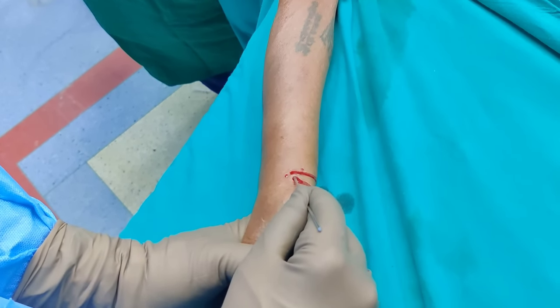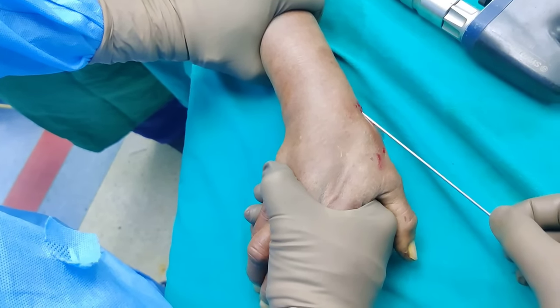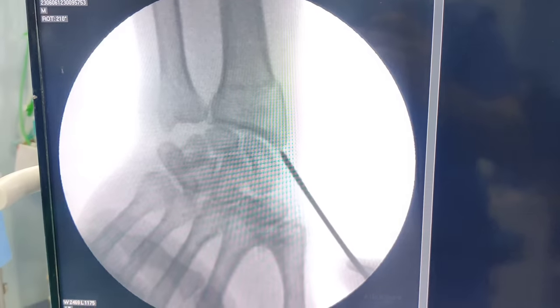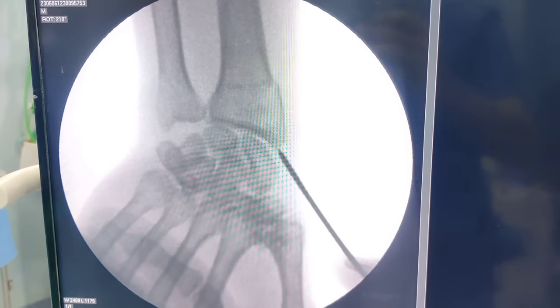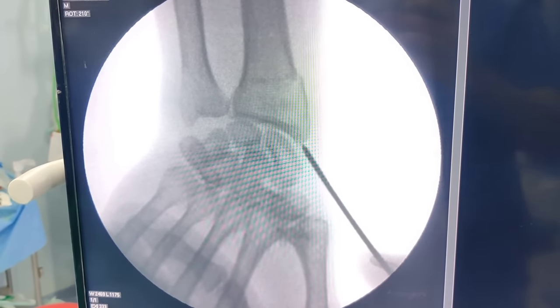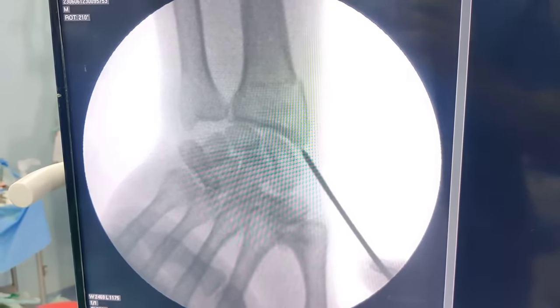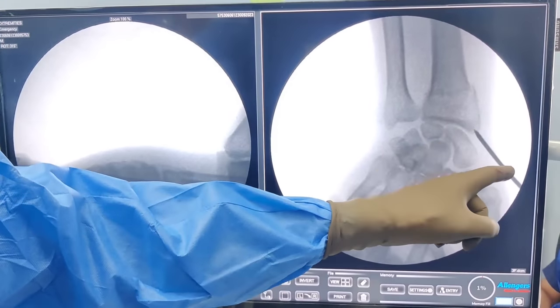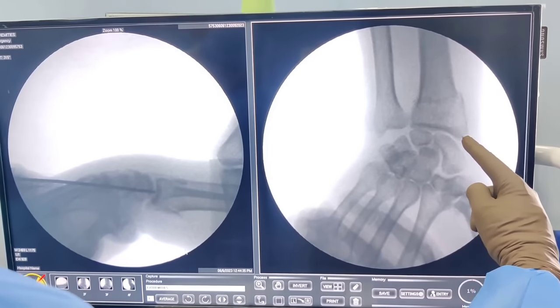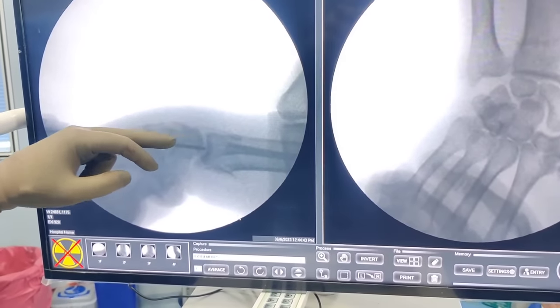I am holding the reduction and Nitesh has used a K-wire to locate the distal radius. Looking at the C-arm image, our position of the wire is pretty central. The trajectory of the wire looks slightly vertical, so we are going to make it more horizontal, and once we are happy we will check the lateral. On AP the wire was slightly vertical, so we changed the angle slightly more horizontal and the trajectory looks pretty good. Switching to lateral, on this occasion we are right on the center.